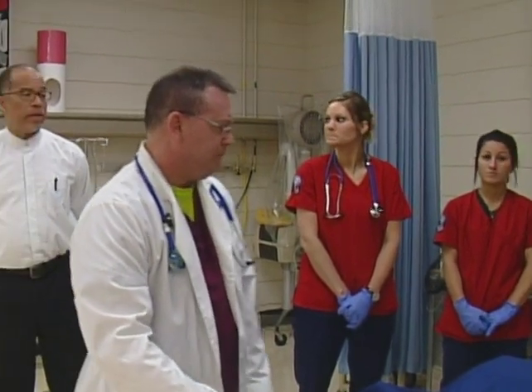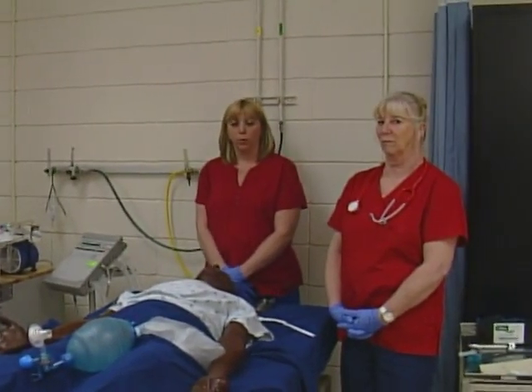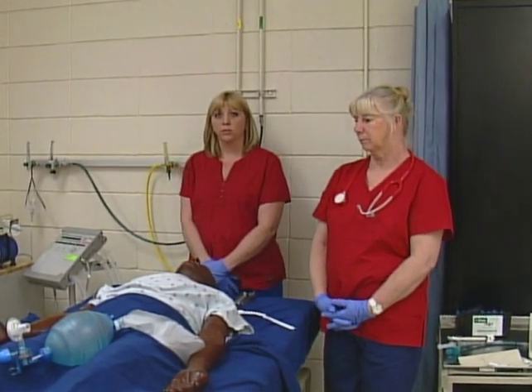And that's a good point, Don, because already our clinical affiliates have expressed pleasure that our students are performing very well and seem to be very prepared to enter the acute care facilities. Today, what we would like to show the Board of Trustees is an intubation procedure on our mannequin.